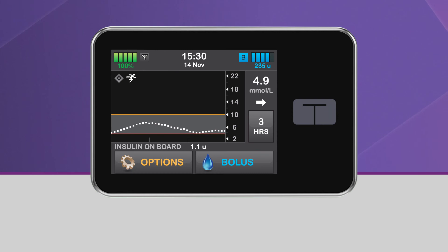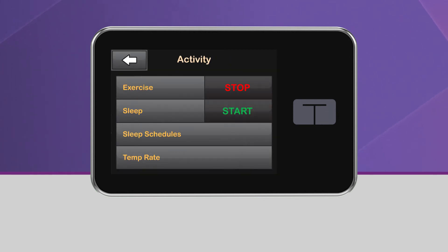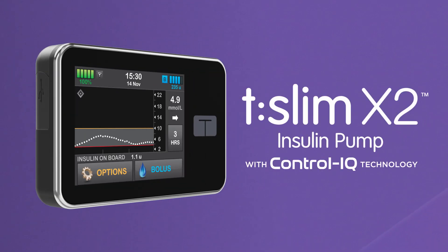To manually deactivate the exercise activity, simply repeat this process and tap Stop. We hope you enjoy seeing how easy control can be with the TSlim X2 Insulin Pump with Control IQ Technology.